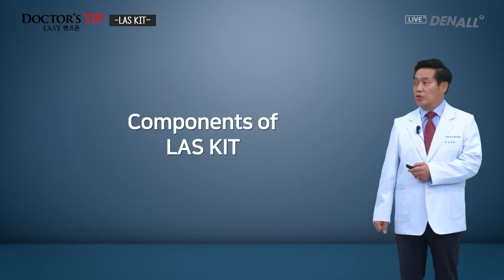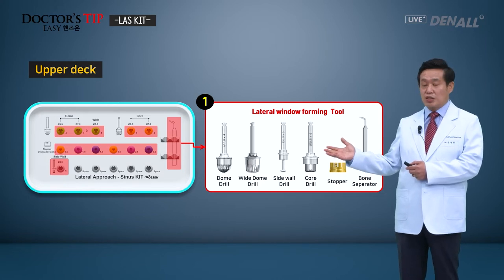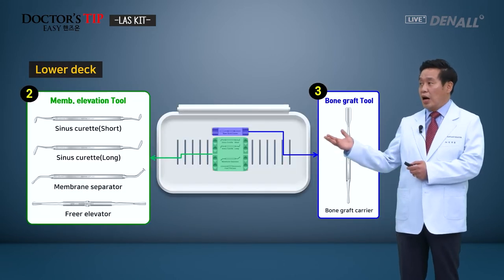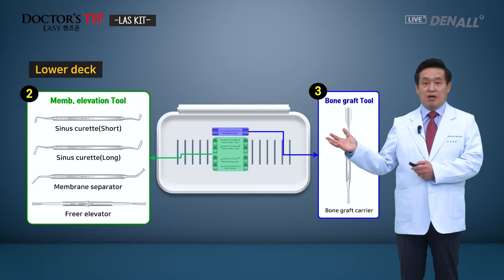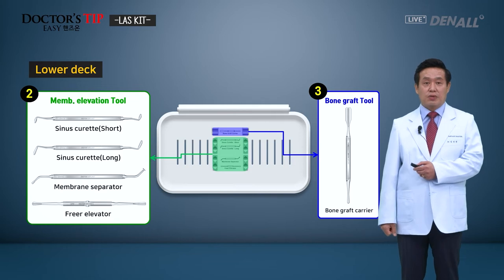So let's see what the components of this kit are. In the upper deck, we have tools for lateral window formation: the dome drill and core drill, and it also has stoppers. In the lower deck, it has tools for sinus membrane elevation. So for sinus surgery, instruments are included, and we also have tools for bone grafting.